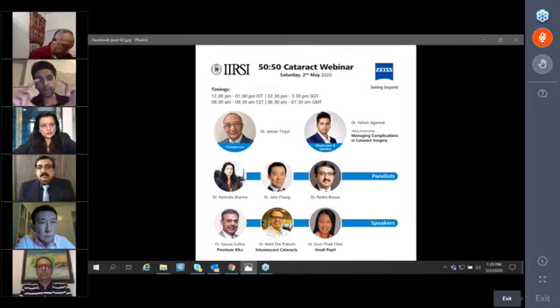I get a clear cornea because I get a nice deep chamber now. Only thing, do not do it for too long, and do not do it if you have a thick black cataract or a white cataract where you can't see your port. You must be able to see your port. That's the only advice that I would give.